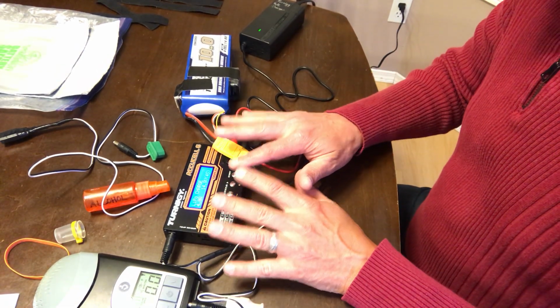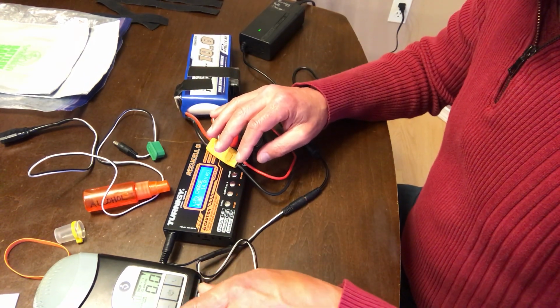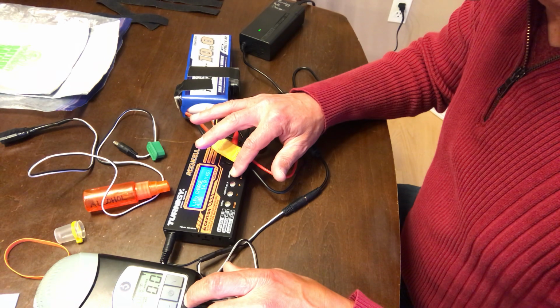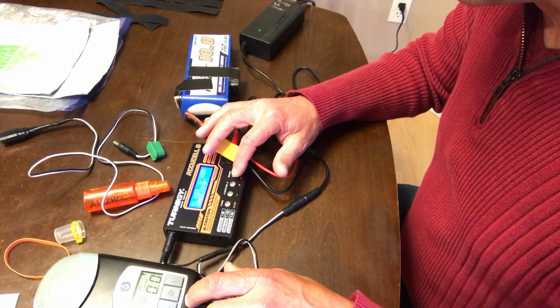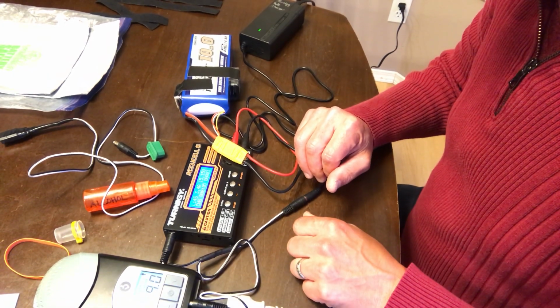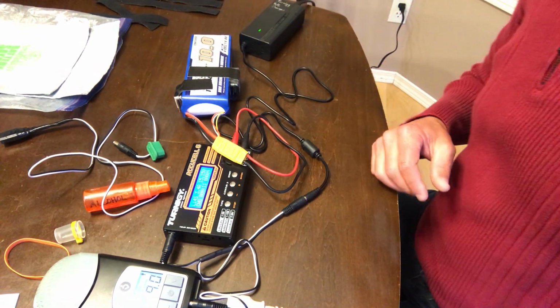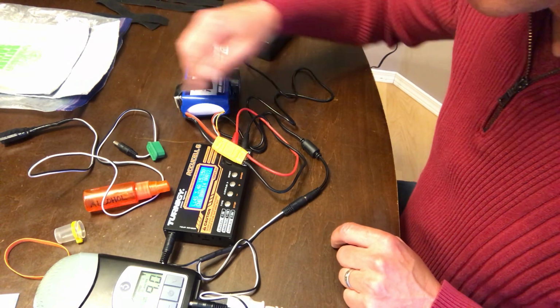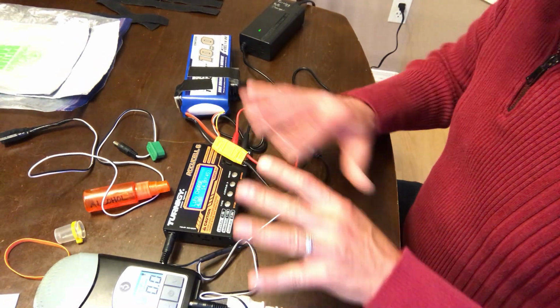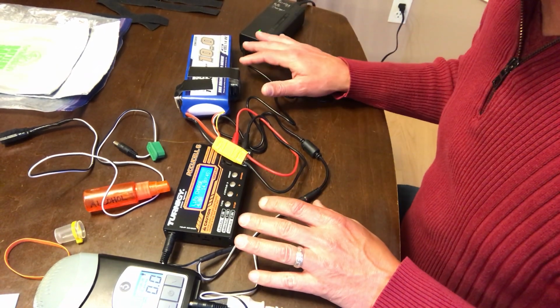So we're not going to charge, but let's just assume, when I'm at a hostel or a hotel, I can run my CPAP machine, my mobile machine, and I can be charging at the same time. In fact, I'll just show you. I mean, you obviously know this will work, but you hit start, it's charging, you can hit start here, and you could at the same time have a USB onto your phone. I don't think I need to do that to show you, but I would constantly charge my phone at the same time. Okay, so we'll turn that off. So that's when you're in a hostel or in a hotel. So you have a wall outlet and you can charge everything, right?